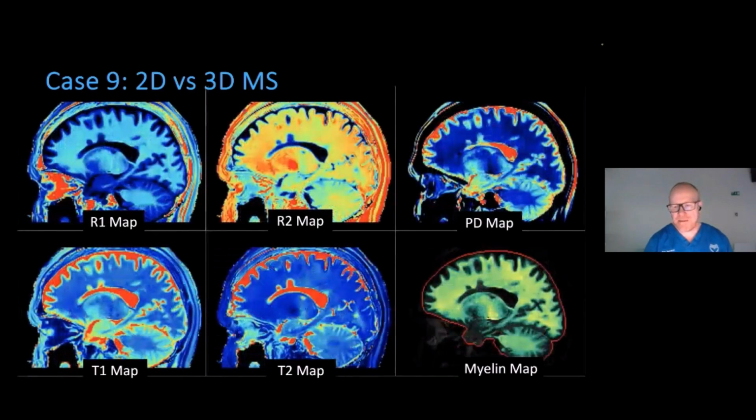We're now seeing exactly what we would normally see, but exquisite detail of the multiplanar reconstruction without any partial voluming. Being able to do this at 1 mil isotropic in the time we're doing is really going to absolutely transform how we do brain imaging going forward.